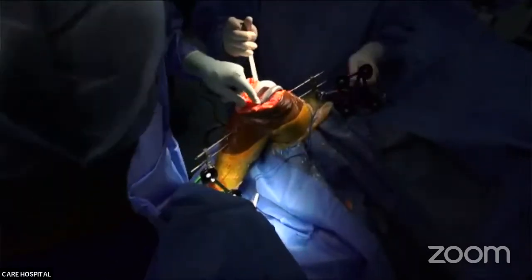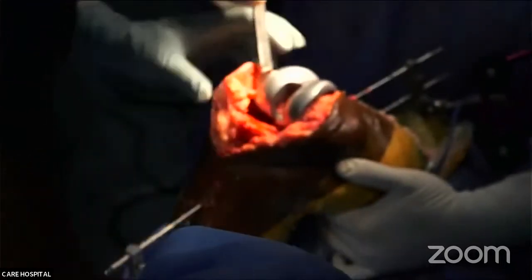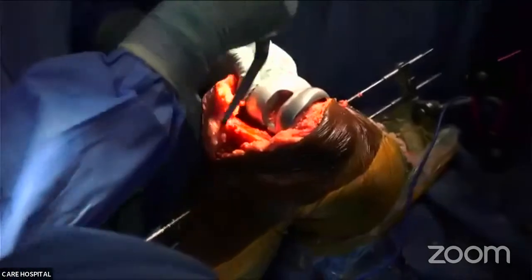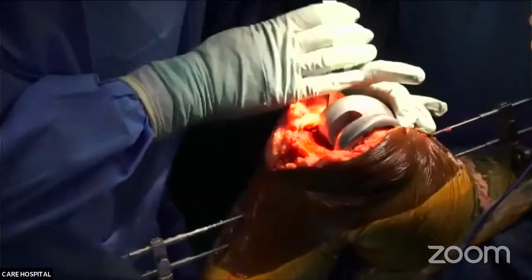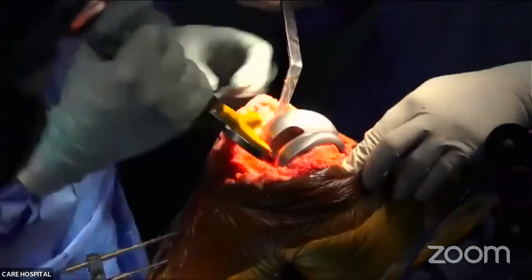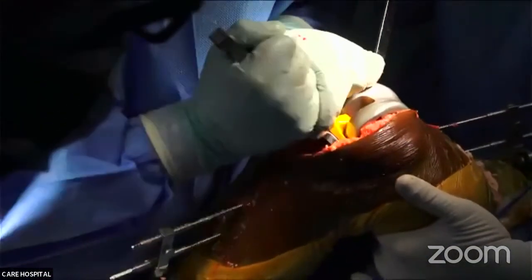Dr. Sekhar, Dr. Padi here. Yes. Please show the screen, how much balance. Just show you again, tibial trial. So till now we haven't done any soft tissue releases except for the initial medial release which we did. But left posterior osteophytes you have removed, I believe. Yes, that we have removed.